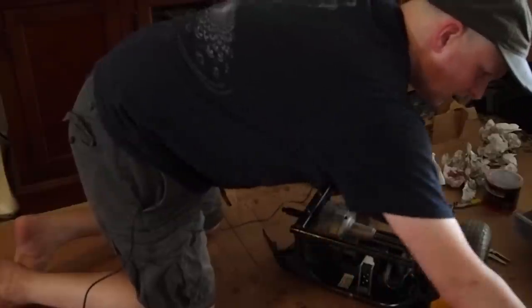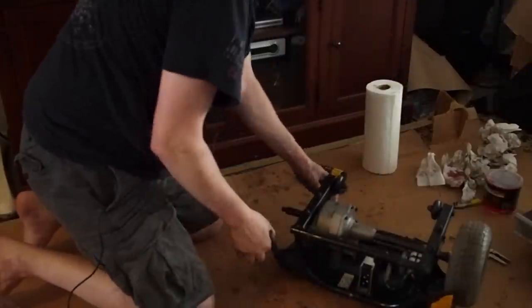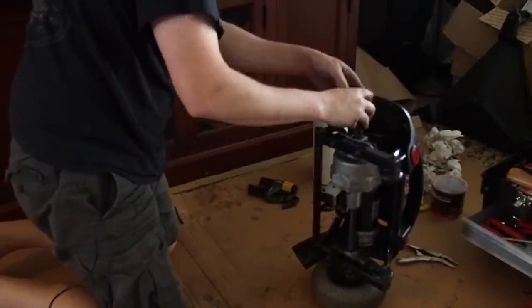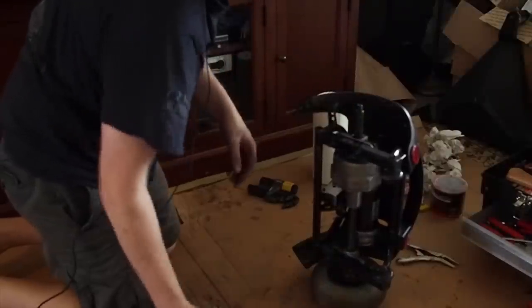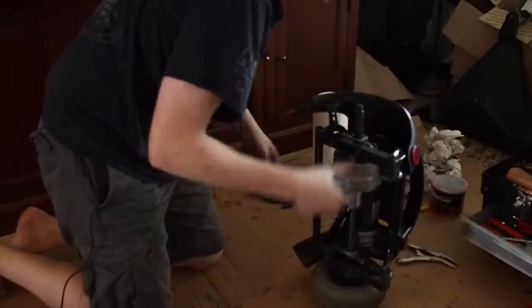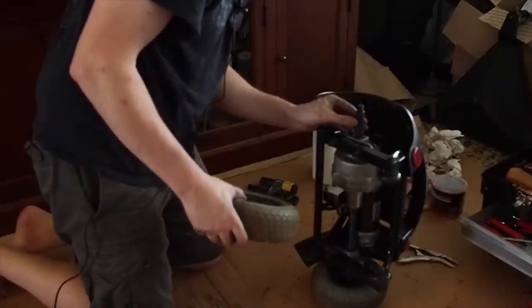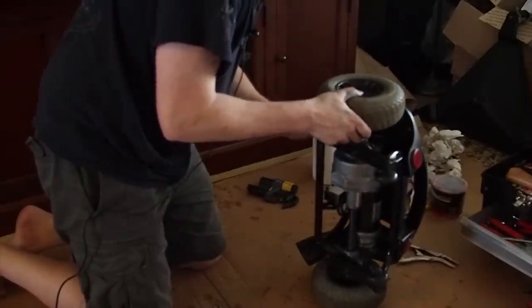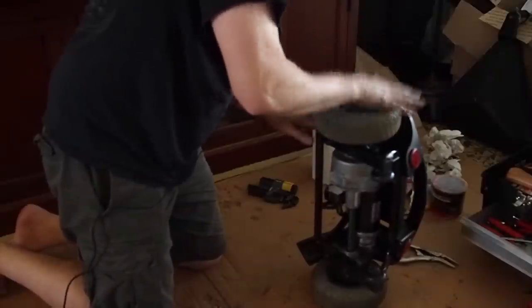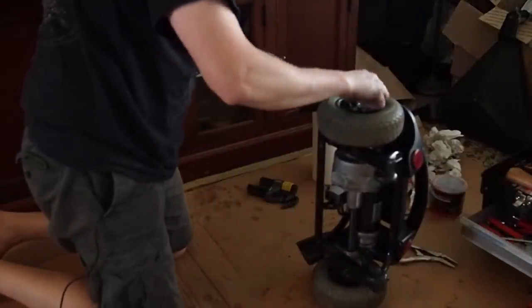All right, so let's get this other wheel on. This is simple enough. This slug goes in there, and the wheel should slide right over top of the slug, although I dropped it. It's right here. Let's put this back on. Let's try this again. I'll hold it in place this time. There we go. That goes like that. This goes like this.